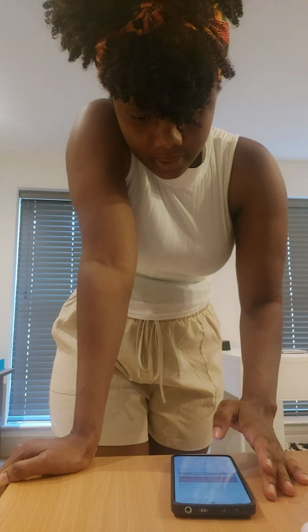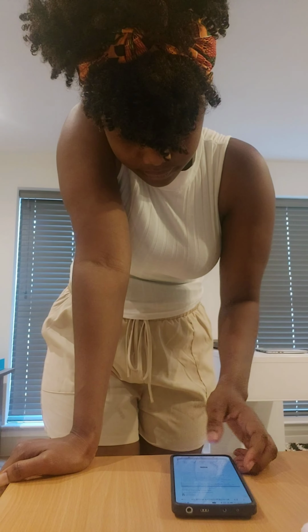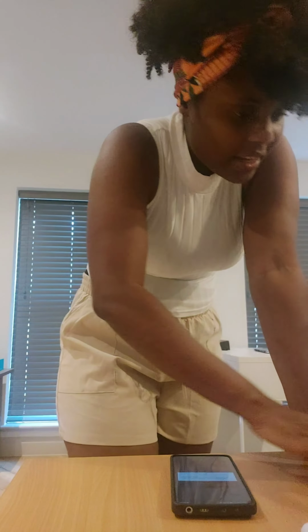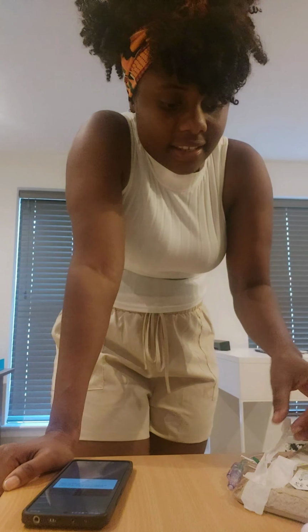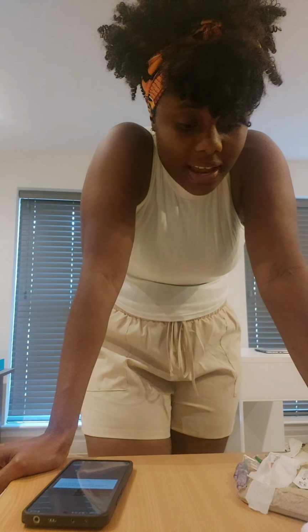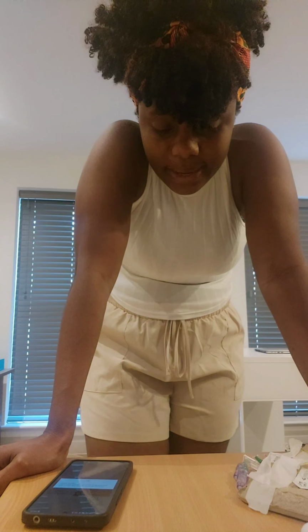Okay, so Annie, I would like to check your IV cannula site. Is that okay? Alright, so do you feel pain around the IV cannula site? No. Okay, so I can see there's no redness, there's no swelling, there's no palpable venous cord around the IV cannula site. So this VIP score is 0, and I can see that the site appears healthy.